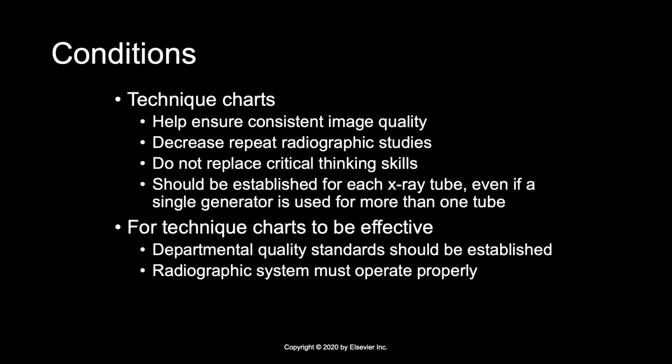So we must continue to use individual judgment and discretion in properly selecting the exposure factors for each patient and each type of examination. Our primary task is to produce diagnostic quality images while delivering the least amount of radiation to our patient.